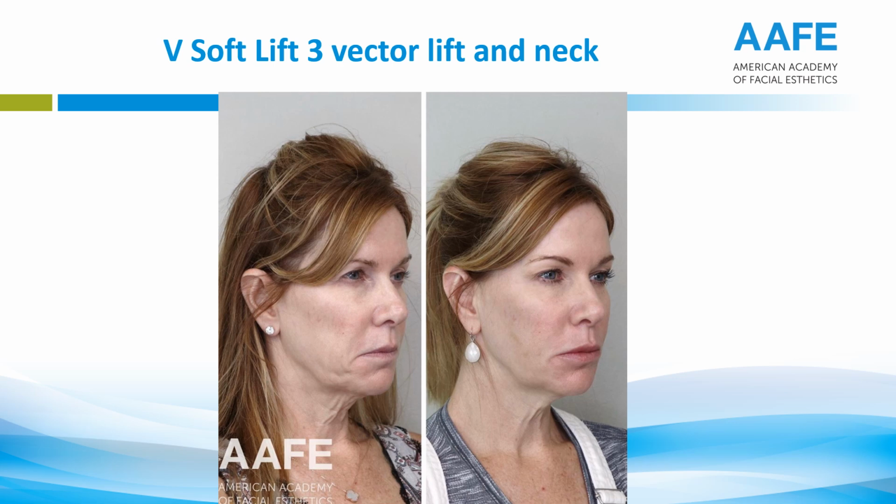But now we want to show you some of the smooth PDO threads, because that's when you really get some of the collagen biostimulation. Now, this is a great start to her transformation. Her transformation is going to involve, like I said, lifting PDO threads, smooth PDO threads, fillers, botulinum toxin, and so let's introduce you to that. So we're going to show you her smooth PDO threads. We're going to talk about patient fees, and then we'll start to show you some before and afters to make this nice and tight for you, so you can really see what is going on here.